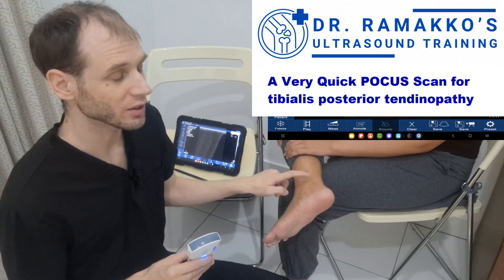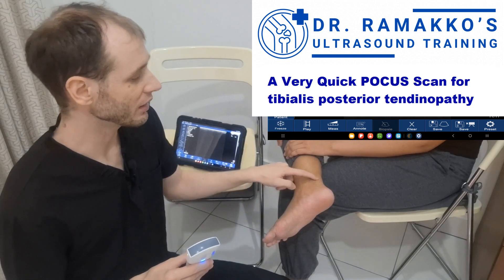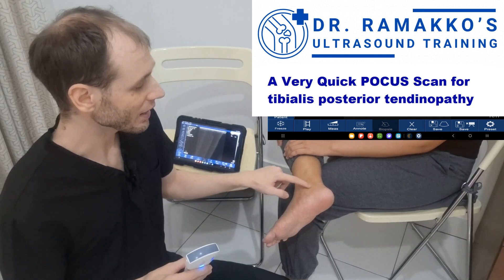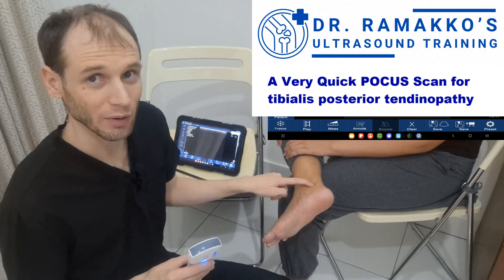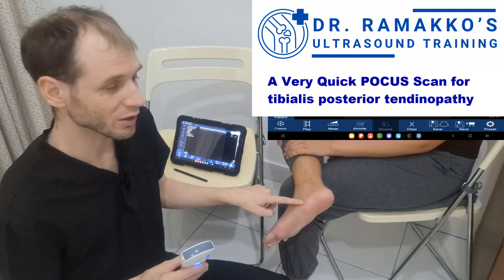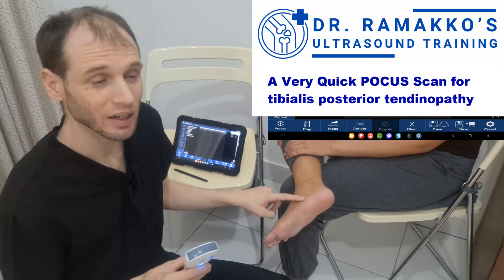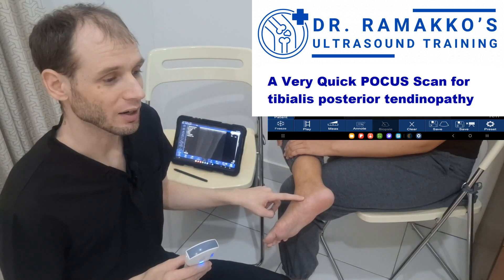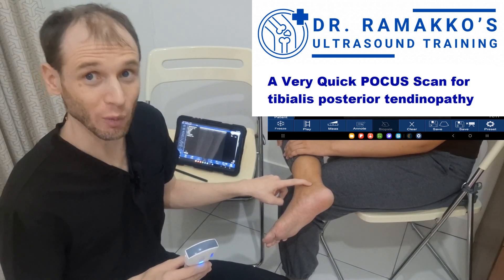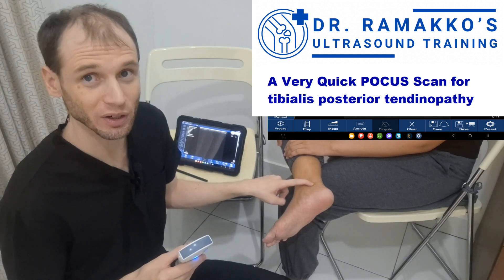This is an important scan to do if you're evaluating for plantar fascia, if you're going to scan the Achilles, or if their pain is medial in any way. If you're more experienced, you can follow it right down to its insertion, although that's not typically where the problem is. You can also evaluate the spring ligament, which is sometimes pathologic along with the posterior tibial tendon. For a quick scan, the one place you're going to check is just posterior to the medial malleolus.